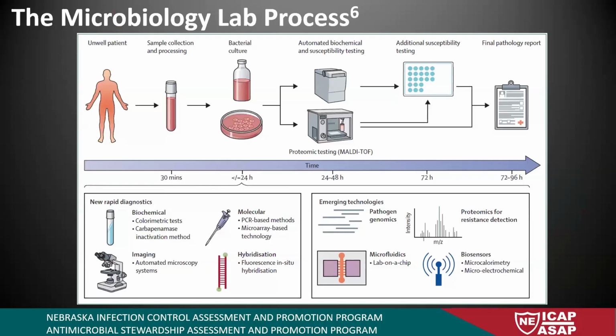Jenna, our pharmacist, found this lovely example of how the microbiology process works within a timeline. I think this is a wonderful diagram to show what they actually do in the lab. So first you have a patient who is unwell for some reason, and a provider orders a lab and says, hey, you need to collect the sample, which if you're a nurse or worked as a clinician before, collecting those samples sometimes is not very fun, but say you have to get a urine sample, blood sample, something else. Anyway, you collect it, you send it to the lab and they start processing it.